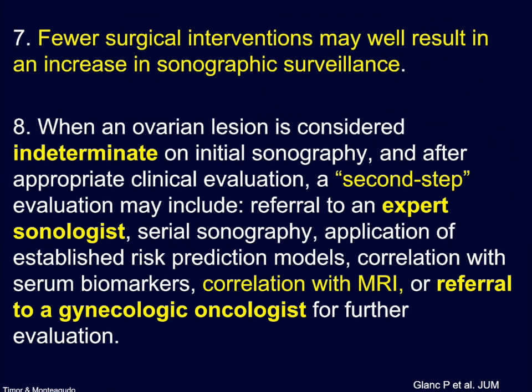When an ovarian lesion is considered indeterminate on initial sonography and after appropriate clinical evaluation, a second step evaluation may include referral to an expert sonologist, serial sonography, application of established risk prediction models, correlation with serum biomarkers, correlation with MRI, or referral to a gynecologic oncologist for further evaluation.